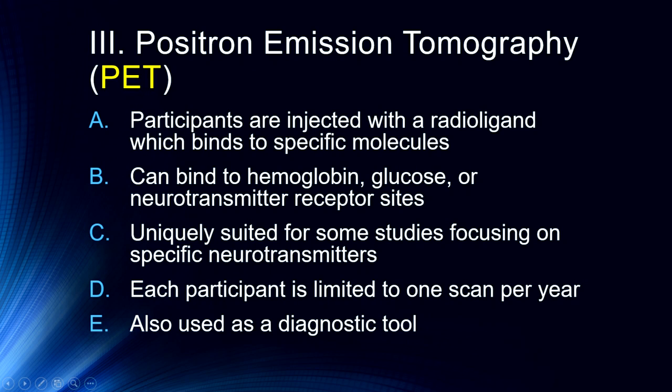So importantly, we can also use PET scans as a diagnostic tool. In fact, their primary use in this current era is in scanning individuals for cancer relapse. But importantly, it's a brand new tool in diagnosing Alzheimer's disease.